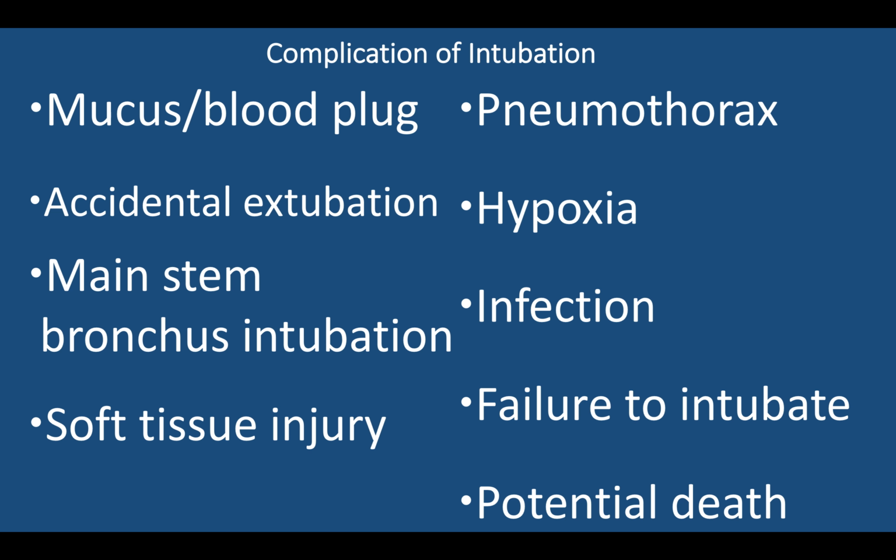Finally, you can always have a death with intubation. If it is a difficult intubation and no one is able to place the endotracheal tube, the patient may die. They may go into cardiac arrest while the procedure is going on. It is a very difficult and dangerous situation to be in. That's why you are doing this now, and you will take every precaution in the future and have the supervision you need when placing an endotracheal tube.